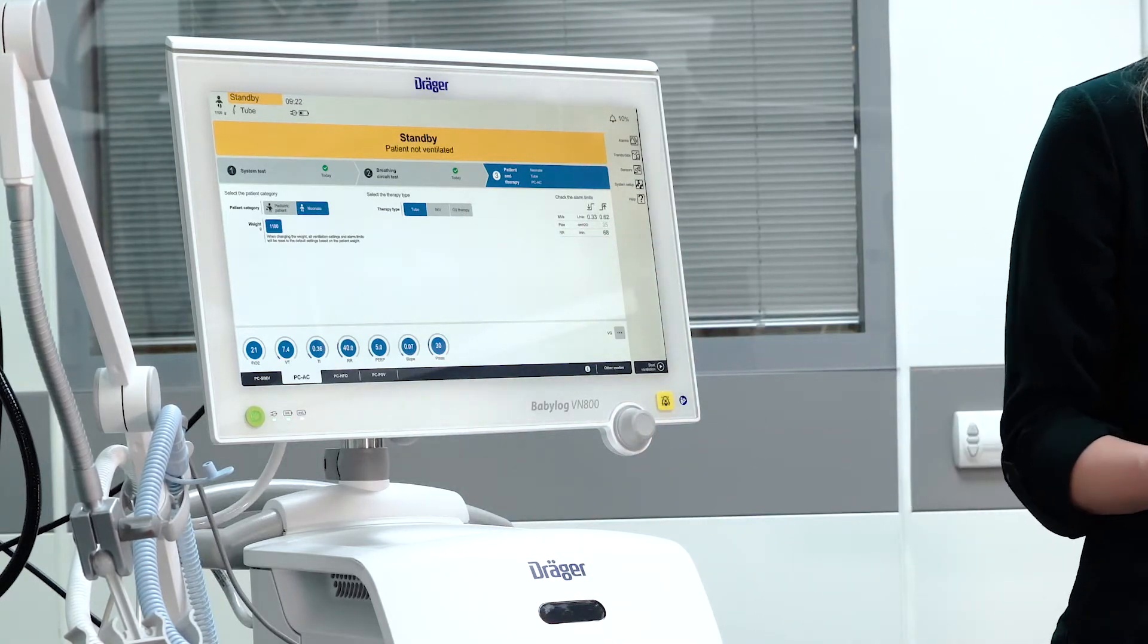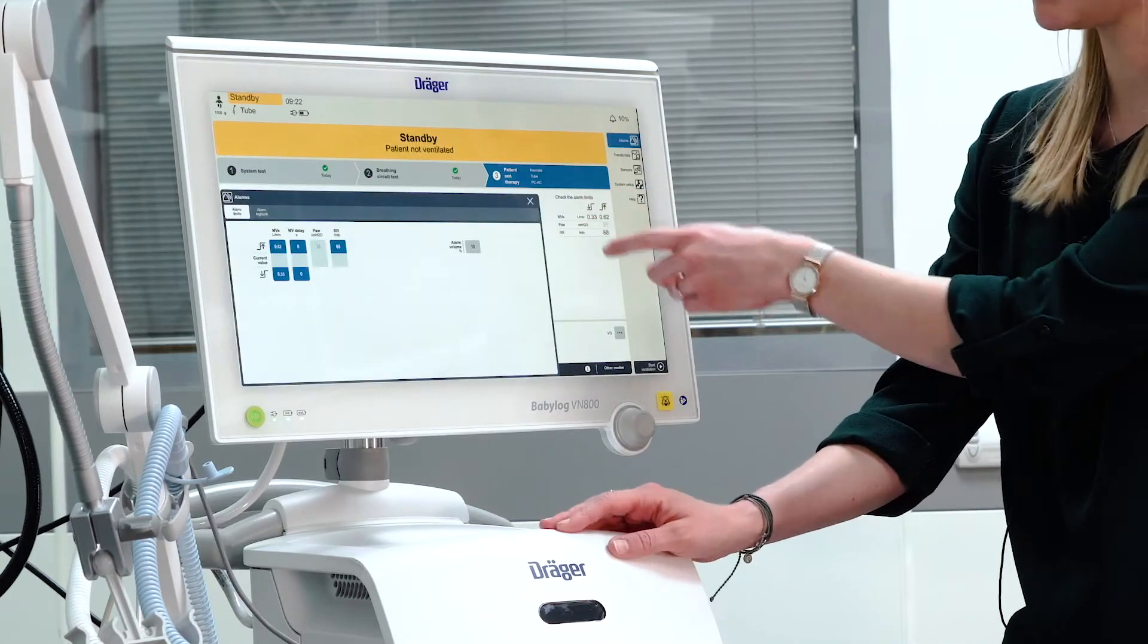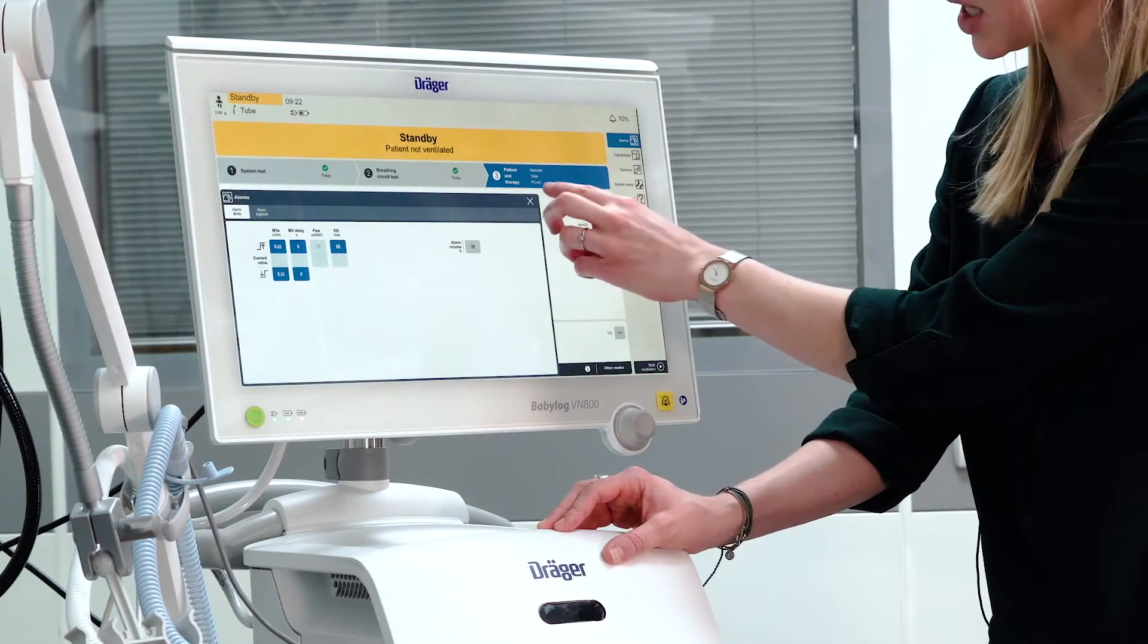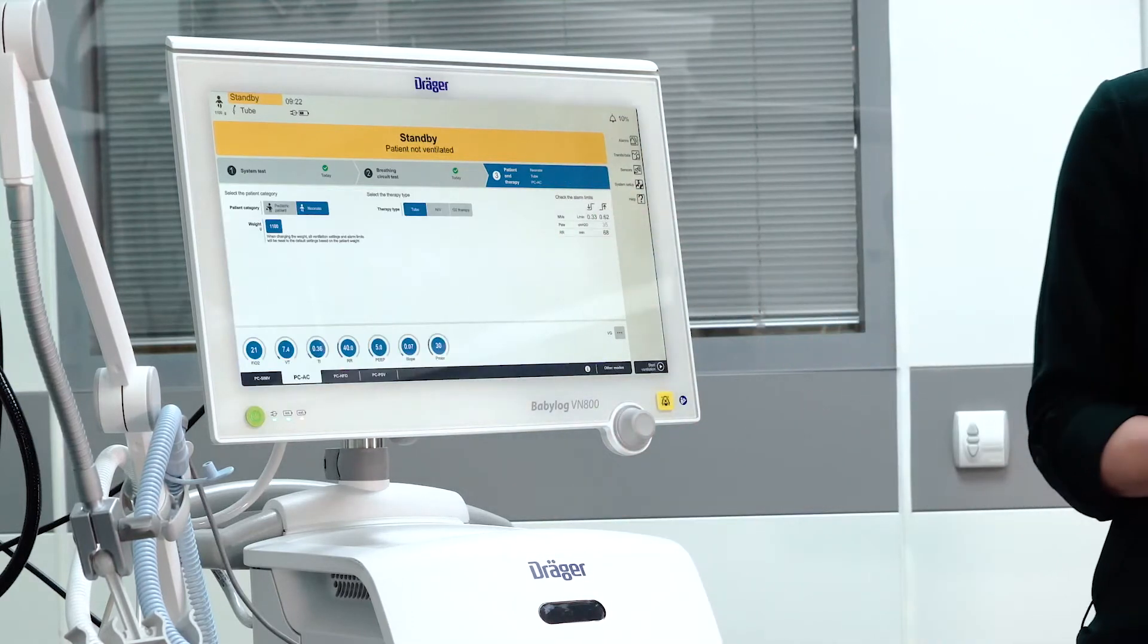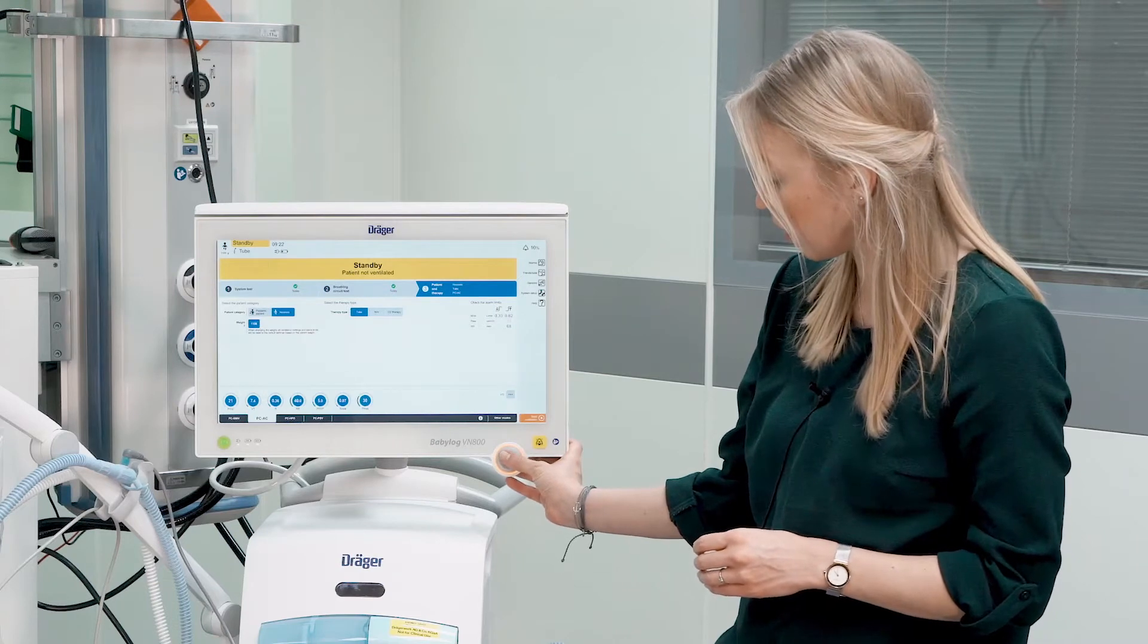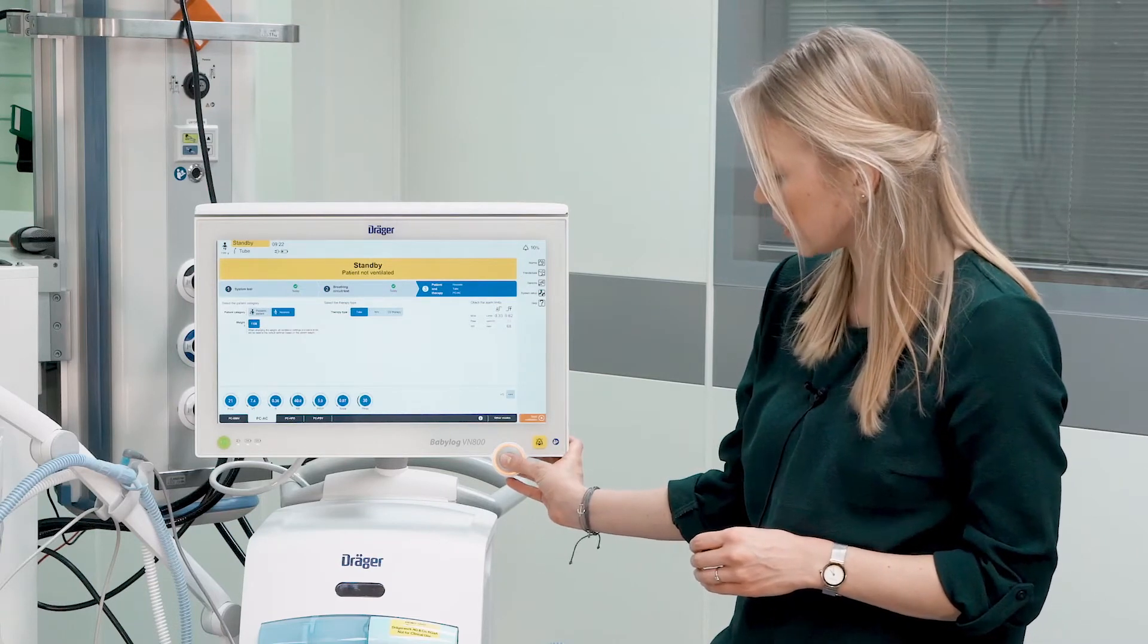Before the start of ventilation therapy, make sure that the alarm limits are set appropriately for your patient. If that is the case, we can start ventilation. Please select start ventilation in the right lower corner and confirm by pressing the rotary knob.